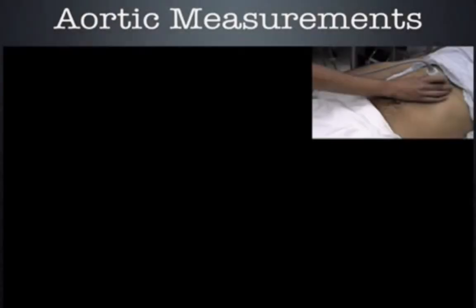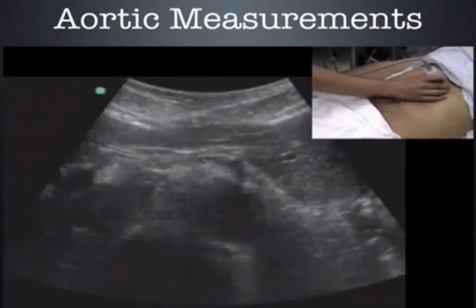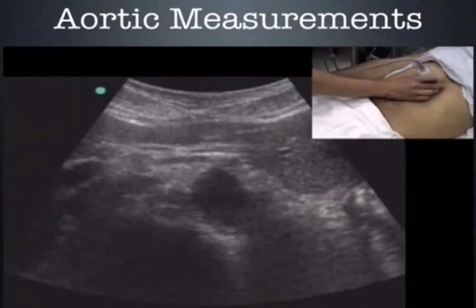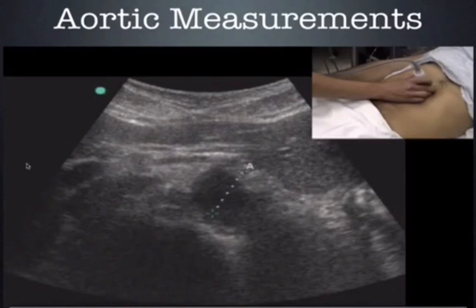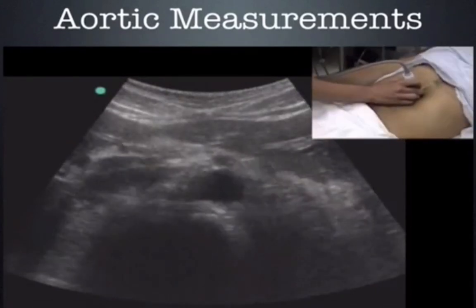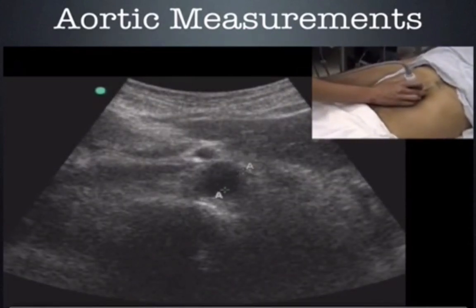Here's an example of how to make your formal measurements of the aorta, largely for documentation purposes. You're going to start with the probe in a transverse plane in the epigastrum with the probe indicator pointing to the patient's right. Start off by identifying the anterior cortex, or the vertebral body, and you will then notice an anechoic structure just to the patient's left of the midline. This is the aorta. Once you've identified this, you'll place your measurement. Here is the superior mesenteric artery — this is our middle segment.